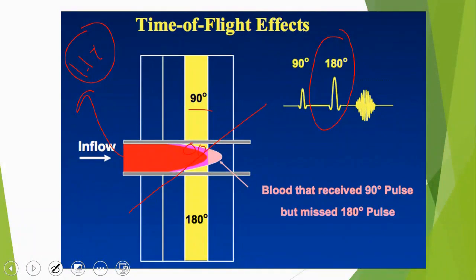The different areas in the gradient will make the frequency of the precession different. So what should I do? For example, I apply a specific gradient. If my gradient is applied in the same direction as the flow of my blood vessel, it means it's moving with me in this way.